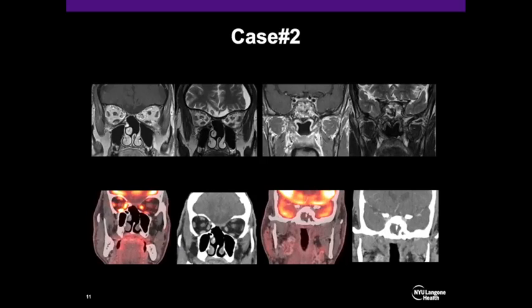And that brings us to our case number 2. This patient is an elderly gentleman. He was treated with resection and radiation many years ago. He has been symptom-free and disease-free for almost a decade, but he presents with low back pain.